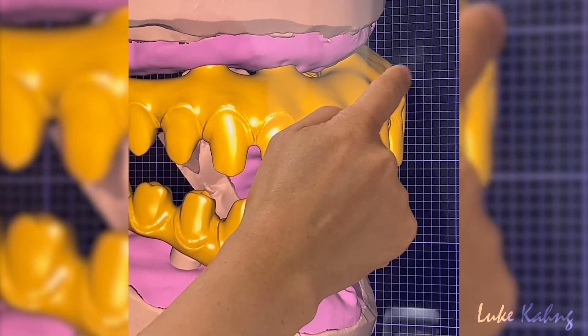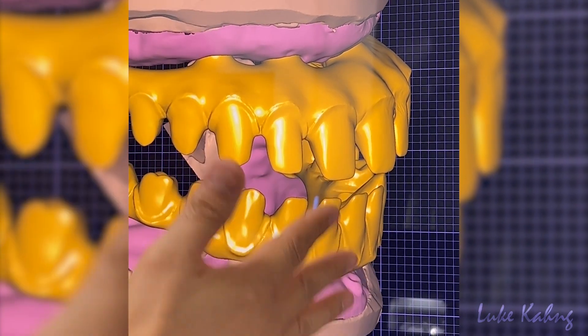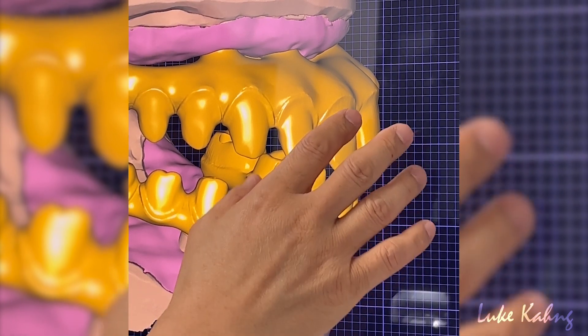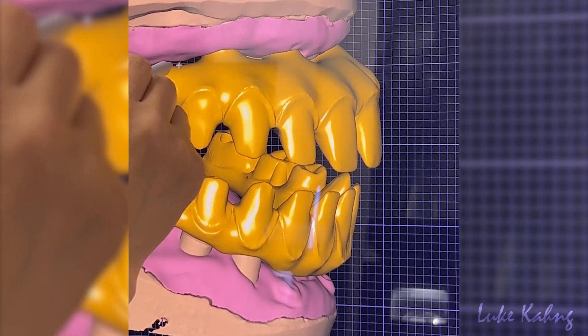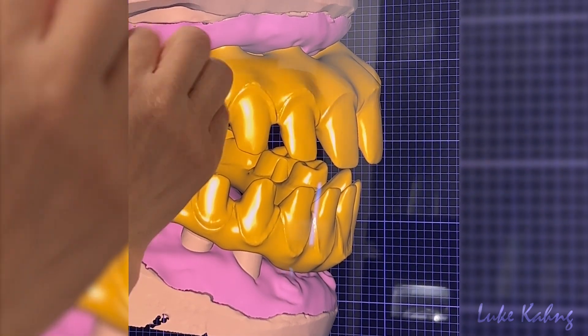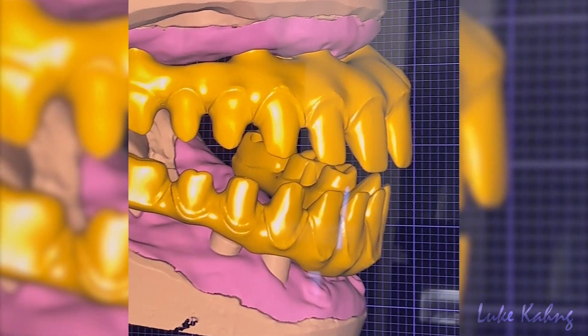You can diminish the area, just bring it in. So trying to make class two should be okay. So our restoration will not be opaque. Whenever you get it, you can make here a little bit more. It should be okay.